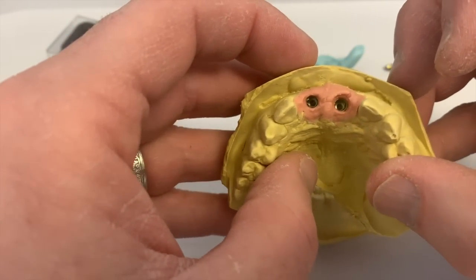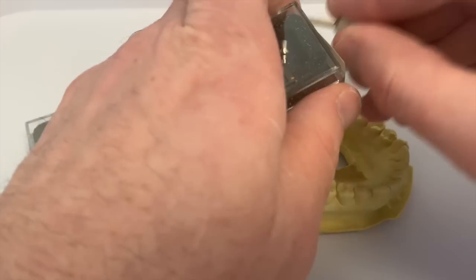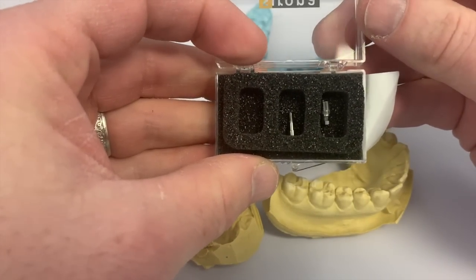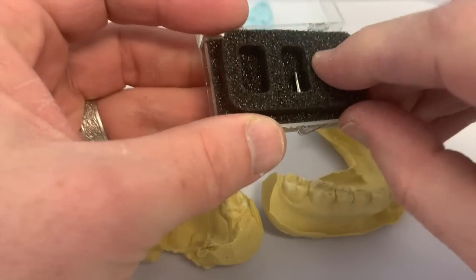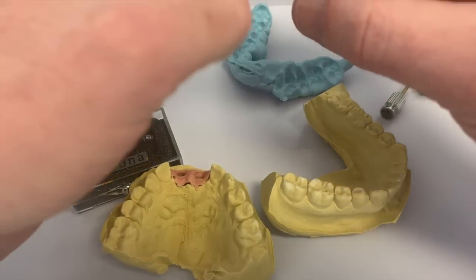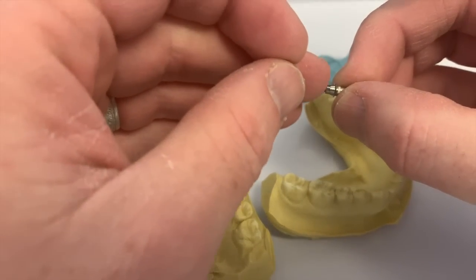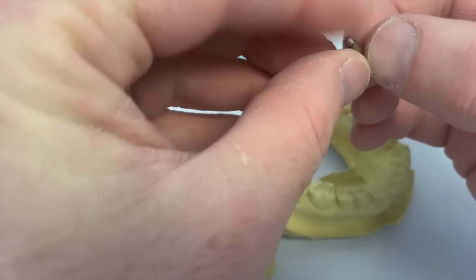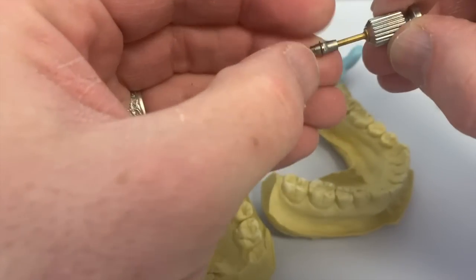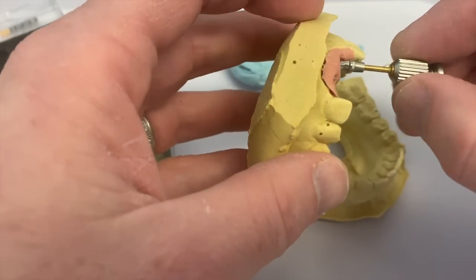Okay, so let's go ahead and get your tibases placed. That one looks like it's going to open easier there. So you can see we have the tibase itself and the screw. And this is the regular platform internal conical connection Nobel Active. I know I've said that 3 or 4 times already. This particular tibase will work with the 5.0 Nobel Active and also the 4.3. So we're just going to place these.